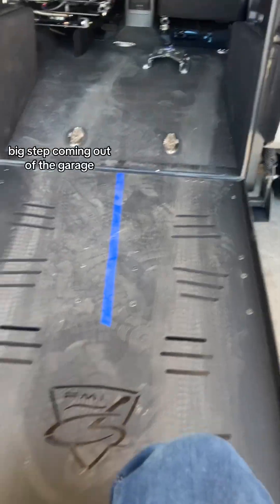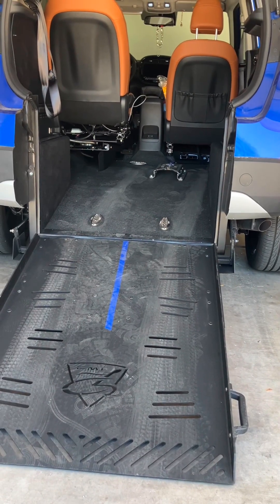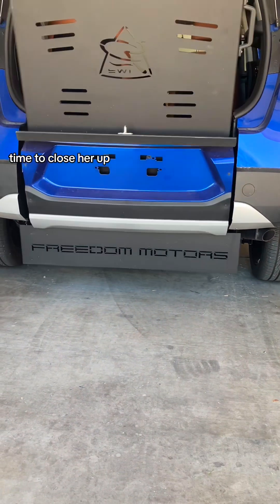Big step coming out of the garage. All right, I'm all backed out, ready to go inside. Time to close her up.